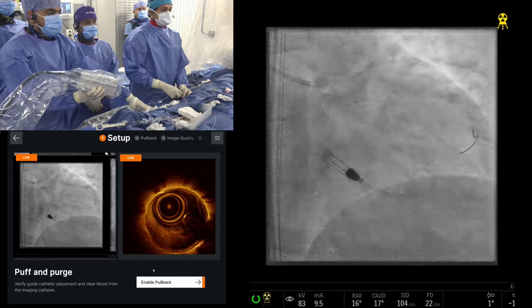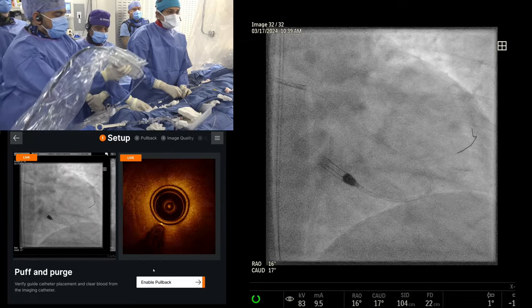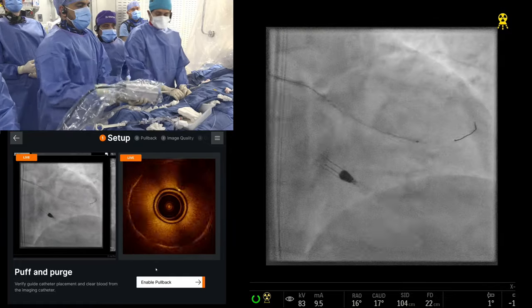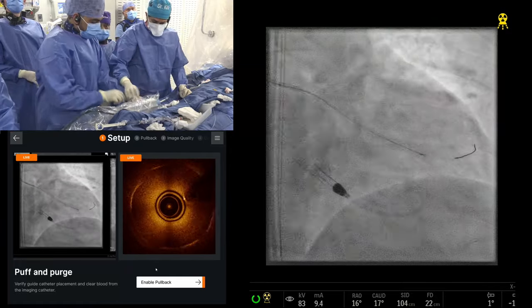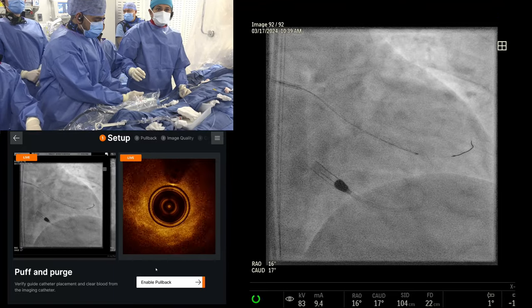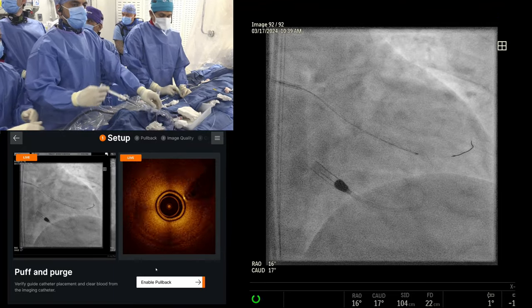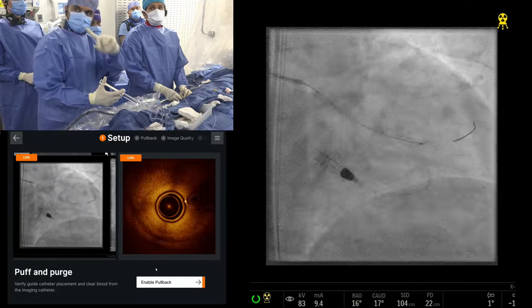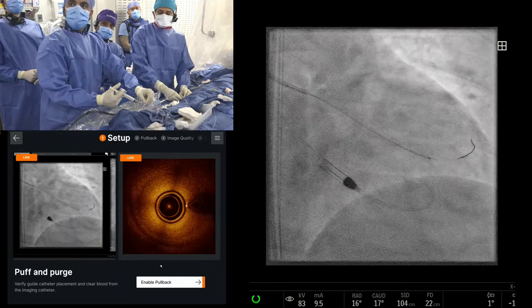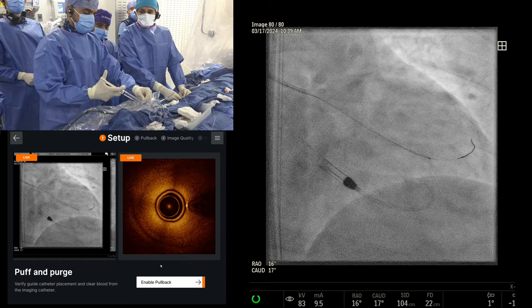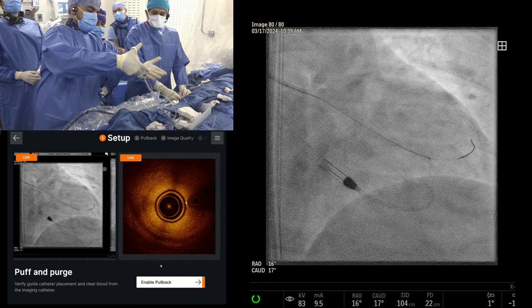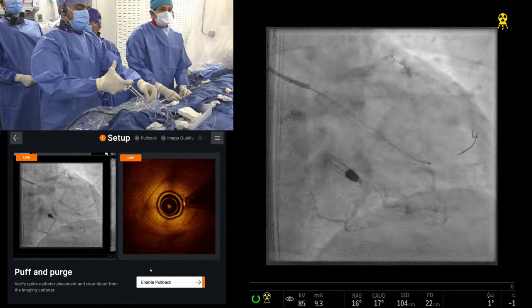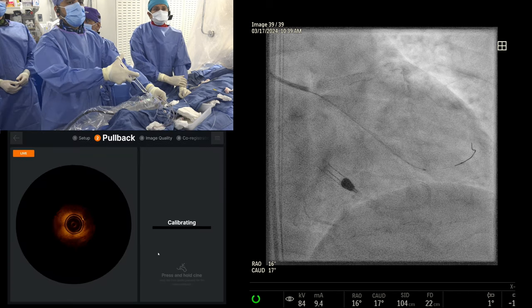This is a really nice case — complex triple-vessel disease, all vessels, very long lesions, moderate calcium, poor EF — and it shows you a well thought-out plan: imaging-guided, Impella-supported, everything stable, plenty of time to make decisions without being rushed. That's our hypothesis for PROTECT 4: Impella support gives you time to do better revascularization and more complete revascularization.